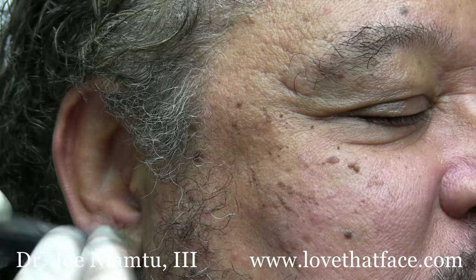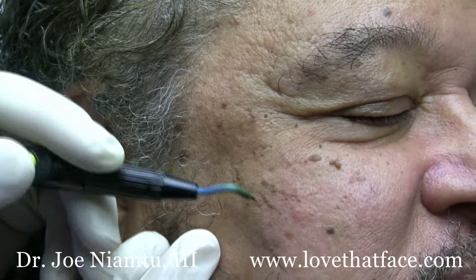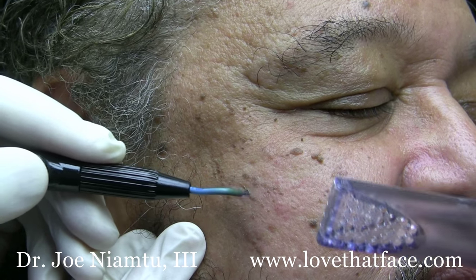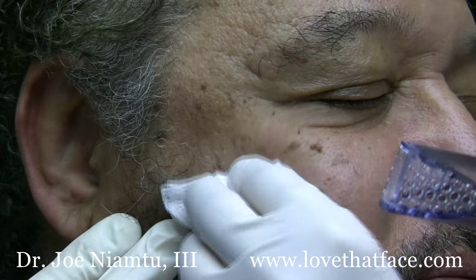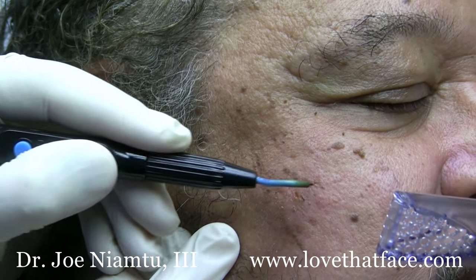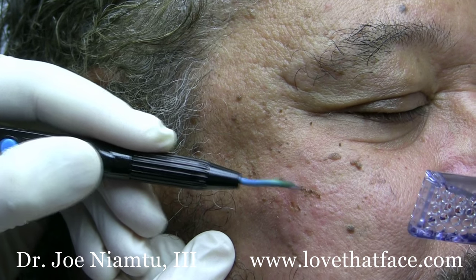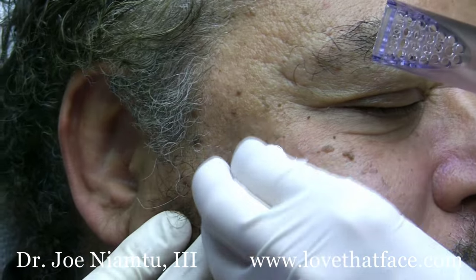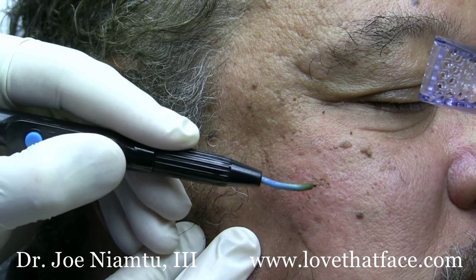This patient is awake and I am voicing over this video because with the particular video camera we're using — a great high definition video — it makes a very loud buzz when you activate the Elman, and we don't hear that buzz on our end; it's just interference. What we're doing is we have our pure cutting using the 133 electrode and we usually set the Elman anywhere between 12 and 20 watts on the pure cutting.